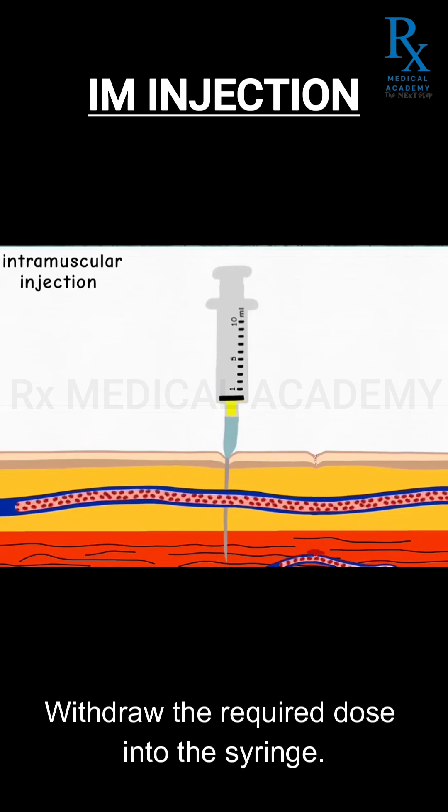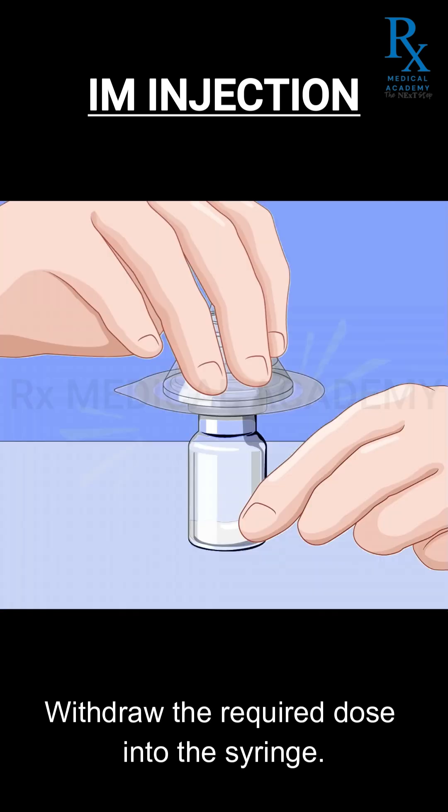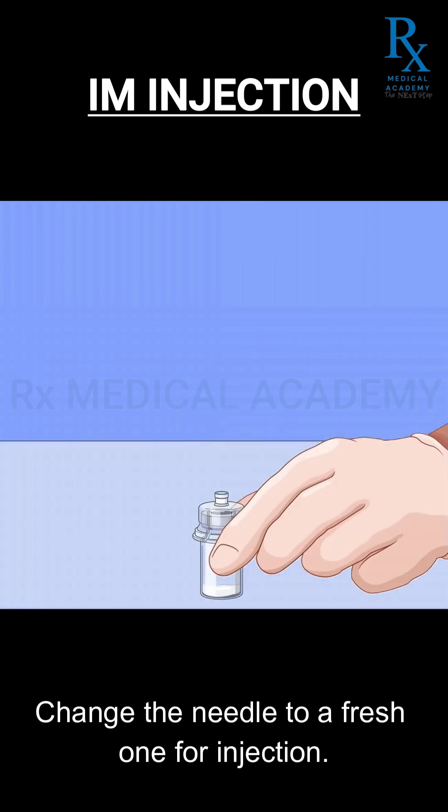Withdraw the required dose into the syringe. Change the needle to a fresh one for injection.